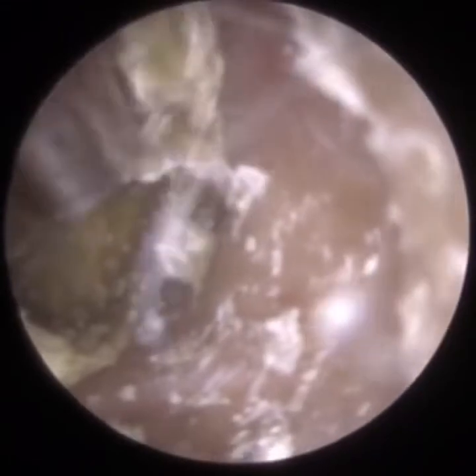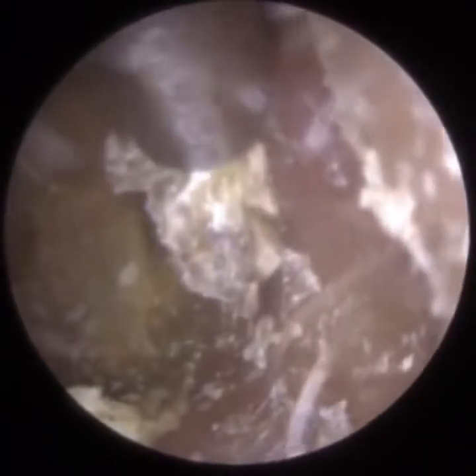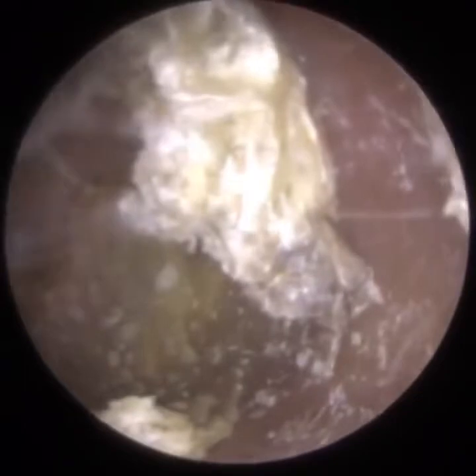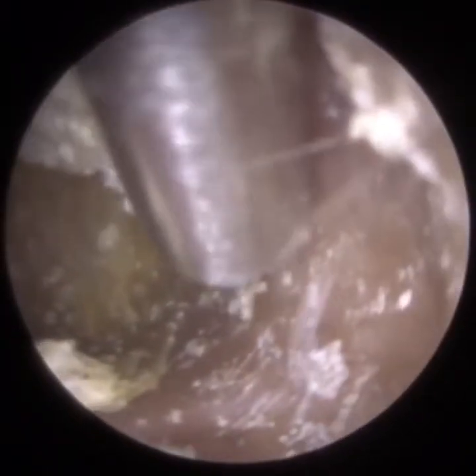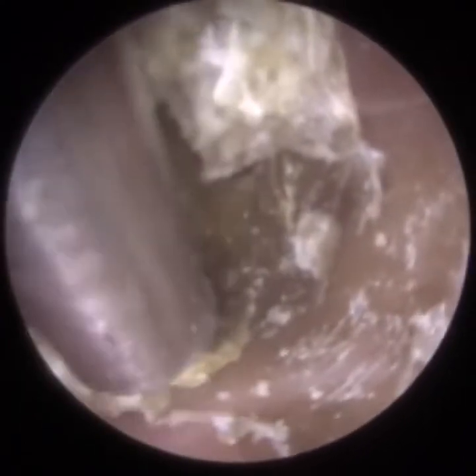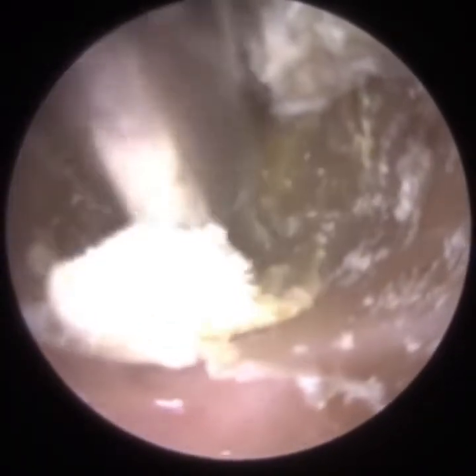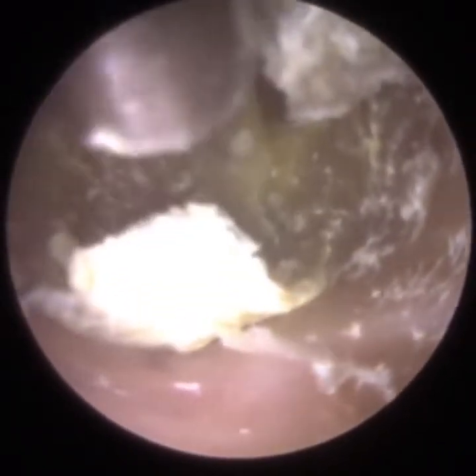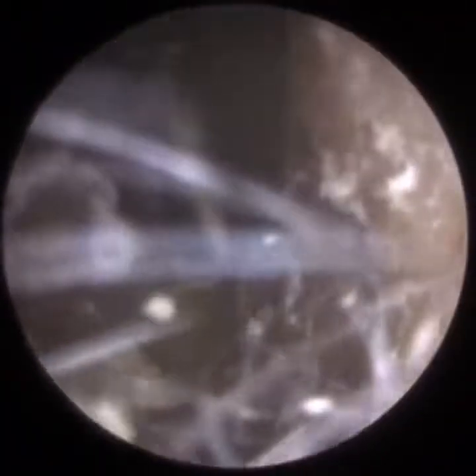So what I'm trying to do is lift this dead skin off the canal wall, elevate it, so I've got something to grip onto with the forceps. If this is still on the canal wall, I can't really grip onto anything. Again, because we're on the bony part of the ear canal, we've got to be ever so gentle and cautious because we don't want to make contact with the bony part of the ear canal, because that can be very uncomfortable for the patient if we do. So I think I'm just going to go in with the forceps now.